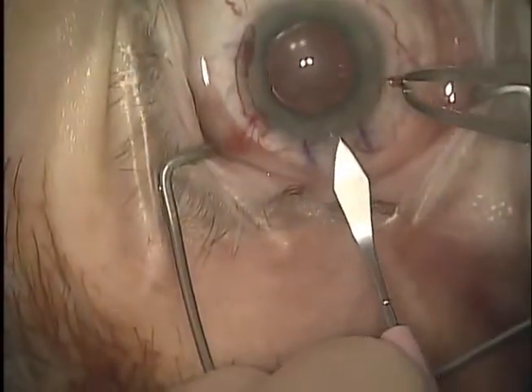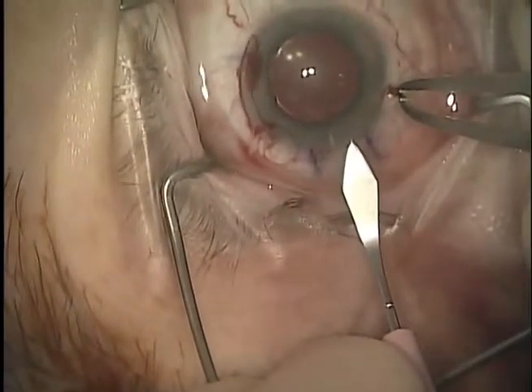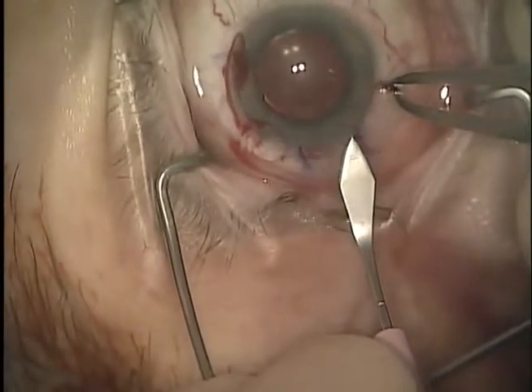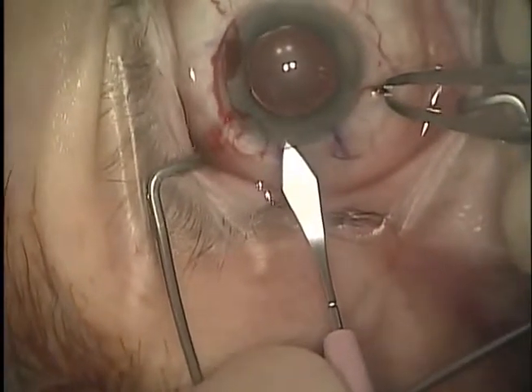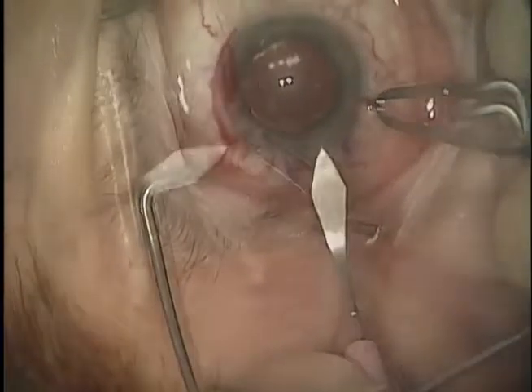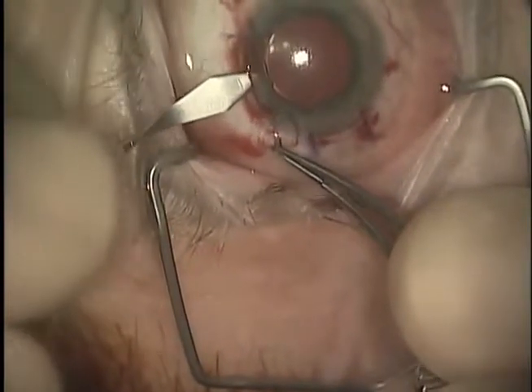A two-site approach was used in order to minimize with-the-rule corneal astigmatism and to maintain a small temporal wound for phacoemulsification. A 0.38mm step knife was used to create a temporal 3.5mm partial thickness corneal incision as well as a 6mm partial thickness incision superiorly. A 2.2mm keratome blade was used to create shelved incisions at both locations.